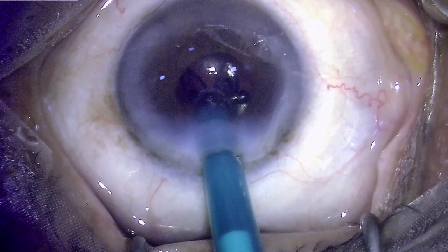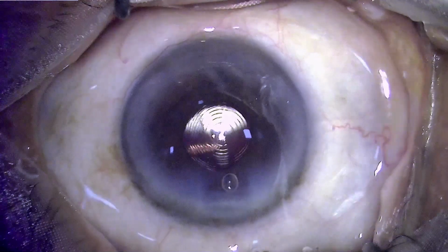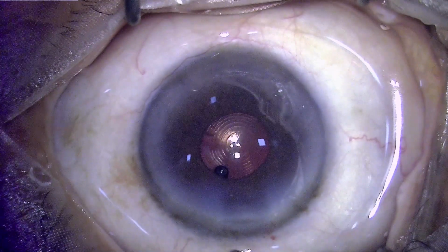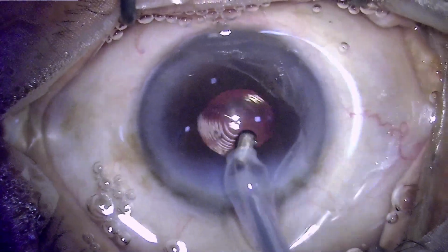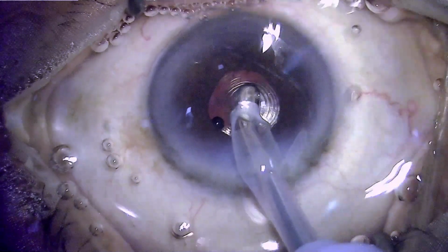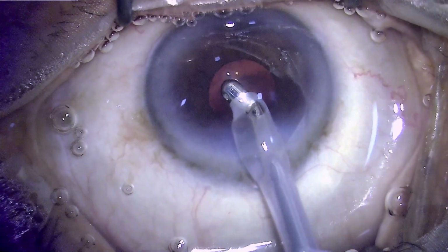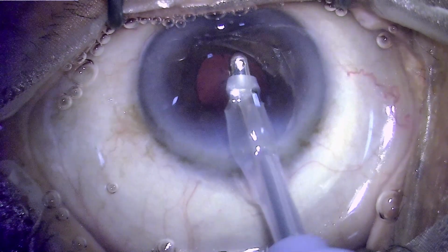And now at this moment we have two reflexes which are formed. These two reflexes, if they coincide well, and more so if they are centered, while the patient is looking at the microscope, then we can see that these three reflexes, which basically reflect the optical center and the visual axis, are coinciding well and are centered at the pupil.